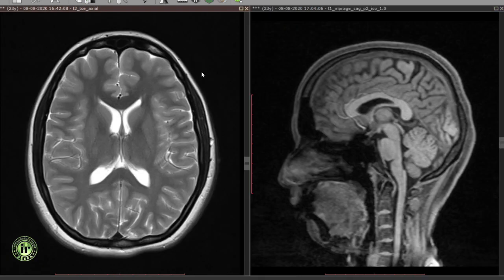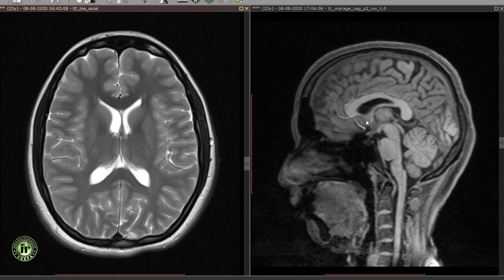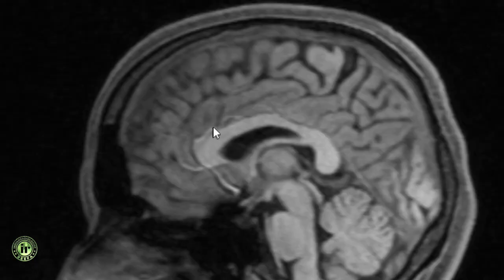The cerebral hemispheres are linked by the corpus callosum. The corpus callosum is a myelinated tract which appears hypointense on T2-weighted images and hyperintense on T1-weighted images. On sagittal section, it appears as a curved structure. The genu or the rostrum is the anteriormost portion which blends into the anterior commissure. The genu curves posteriorly and superiorly towards the body and then to the splenium of the corpus callosum.